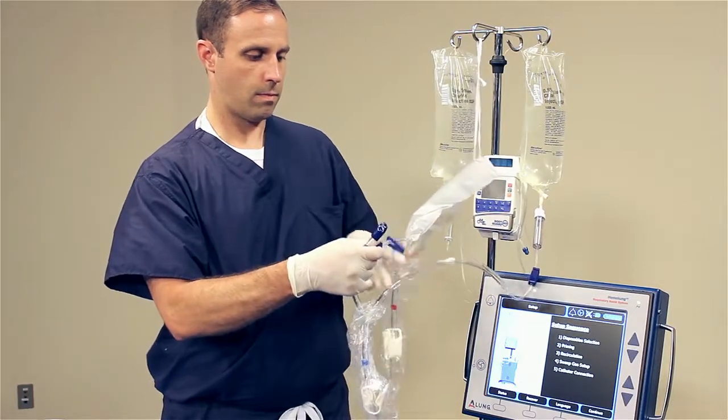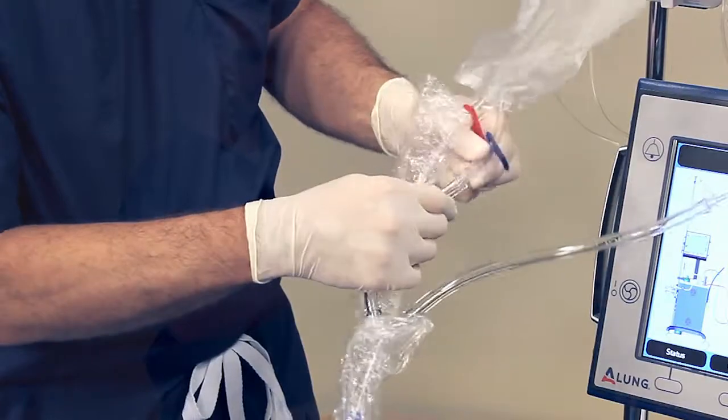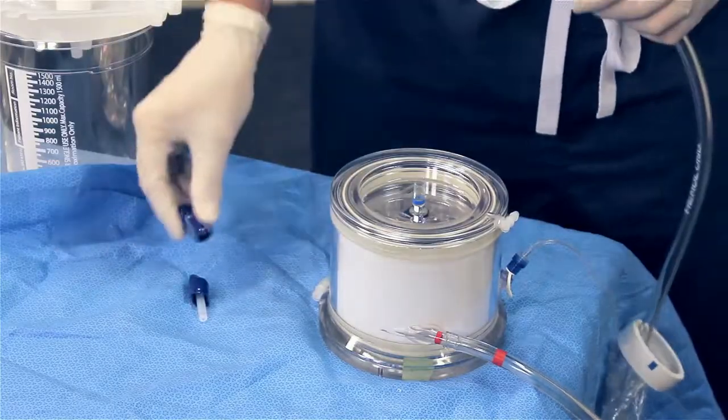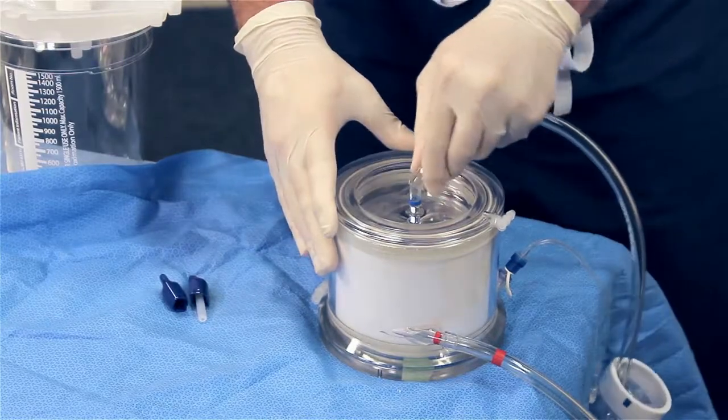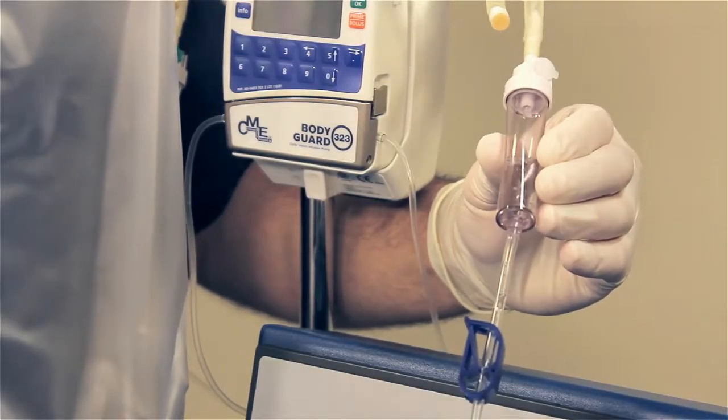Spike the priming solution. Connect the short tube of the blue tubing set to the barbed connector on the recirculation bag. Connect the free end of the blue tubing set to the blue inlet connector on the top of the cartridge.